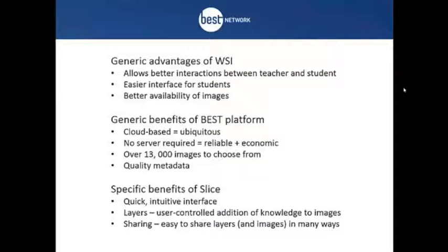In particular, Slice has benefits because it is quick, it's intuitive as an interface, and, what Danny's already mentioned, it has layers. Layers are a really important way of people being able to add and control knowledge that they have about their images and share that knowledge with others. And they're the particular aspects of Slice that I'm keen to show you today.